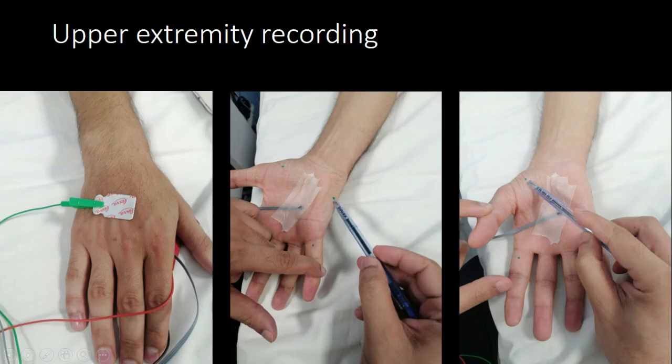So this is for APB. This is for your ADM, okay? And this is for the sensory.